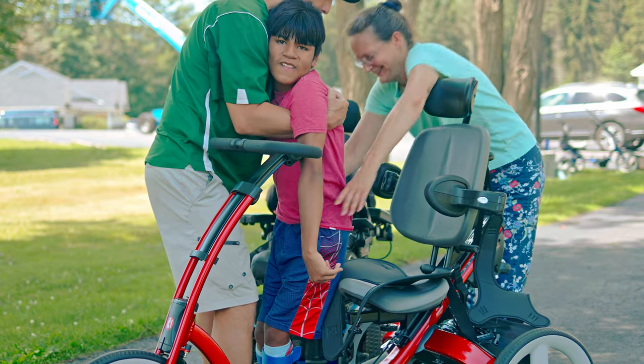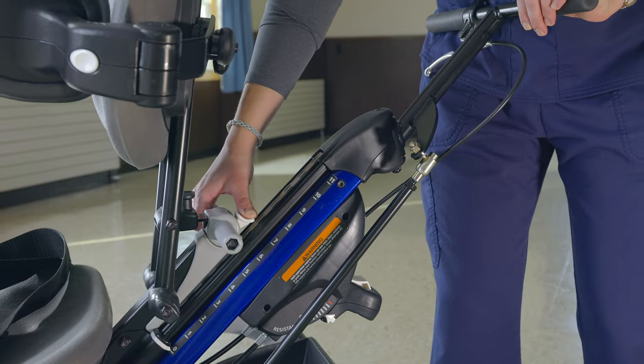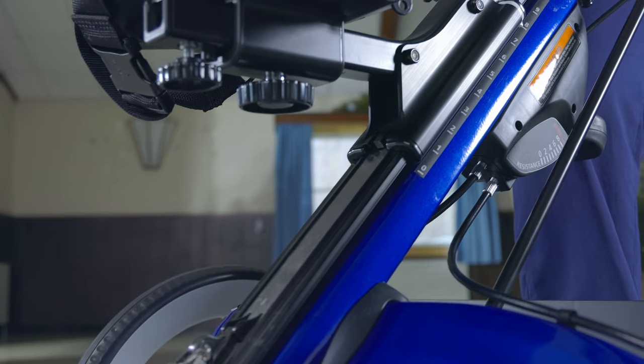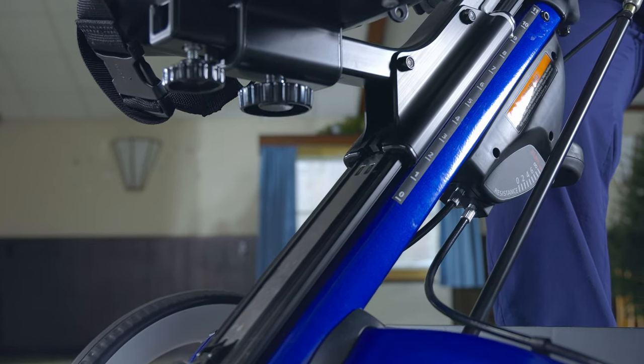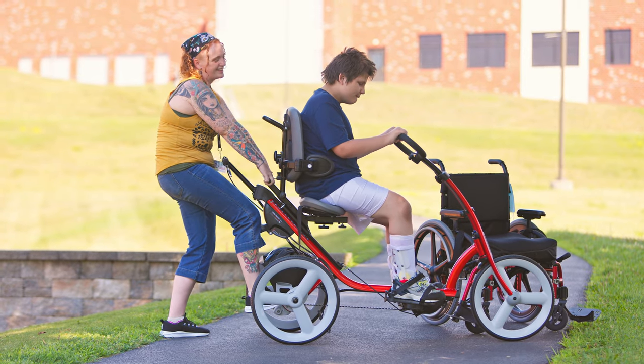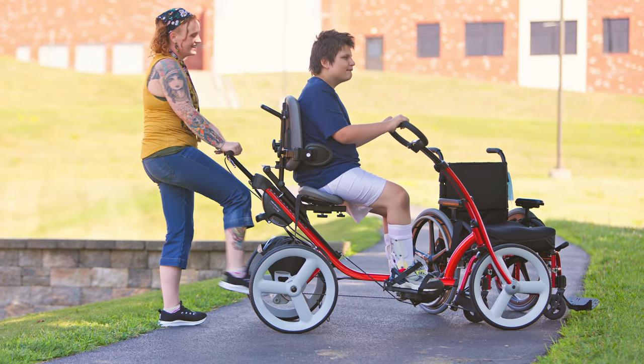One important feature is the seat height adjustment. The seat and backrest slide on a low-friction rail, so by squeezing this trigger, we can move the seat up and down easily. The latch mechanism is secure and durable, so if the rider has enough leg strength to help out, it's not hard to raise and lower the seat while they're on the tricycle.